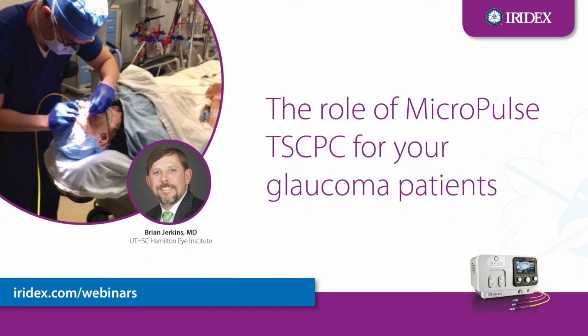So we've all had some thoughts and concerns over prostaglandin use and the potential for CME. When you recommend MicroPulse to your patient, do you do a macular OCT on everybody to try to weed out potential CME cases that maybe are subclinical or just have a small amount, you know, being an inflammatory treatment and potentially kind of stirring that up afterwards?